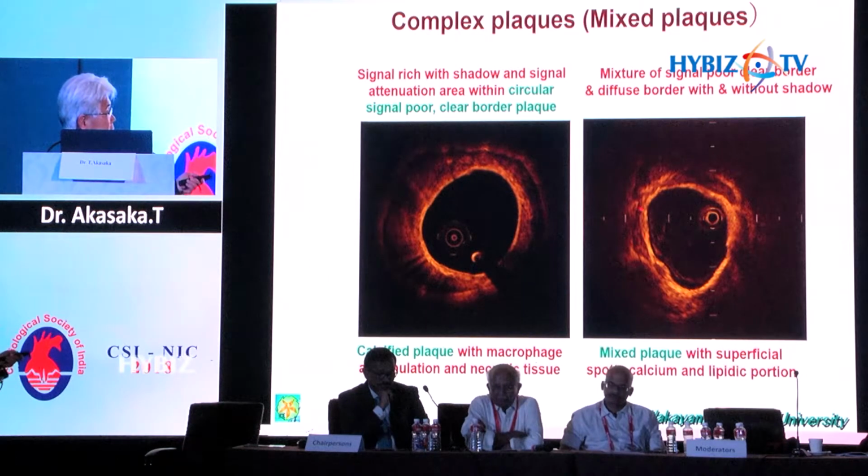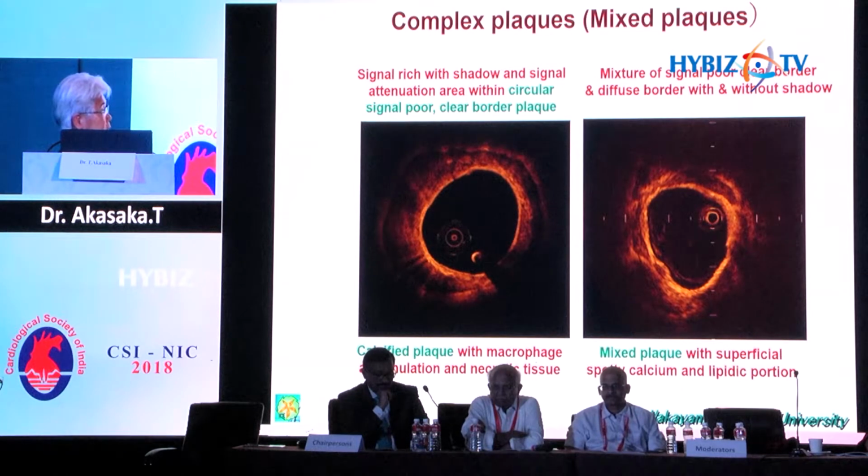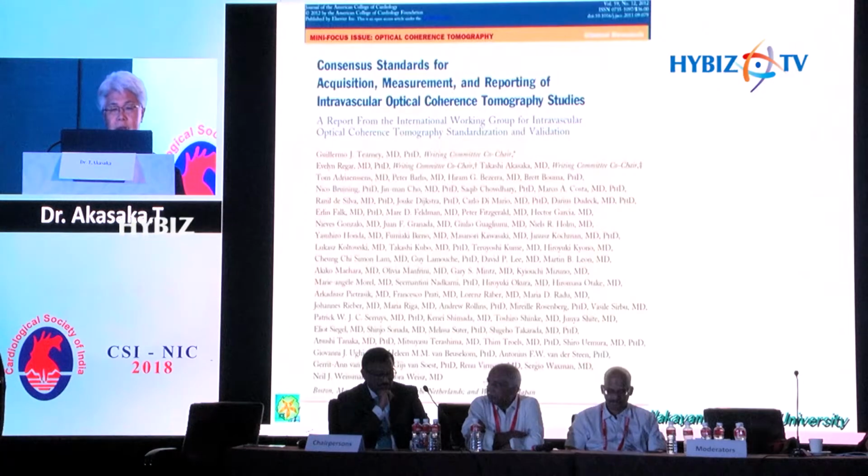You can identify several spotty calcium here and here and here, and from 3 o'clock to 6 o'clock, there is a diffuse border, signal-poor region. This might be the lipid. So the true plaque is much more complex. This is mixed plaque, as you know.